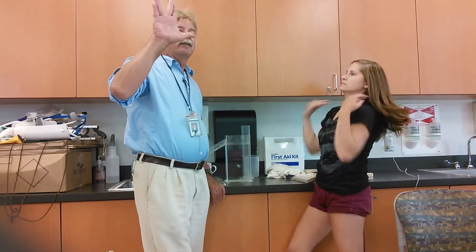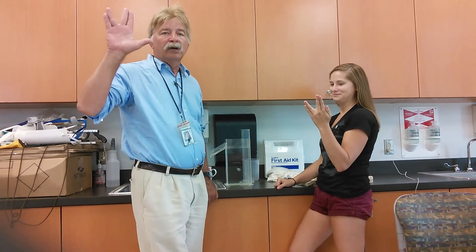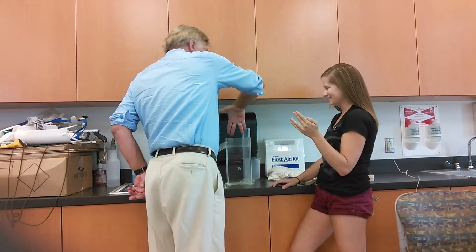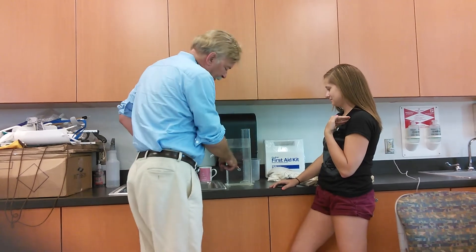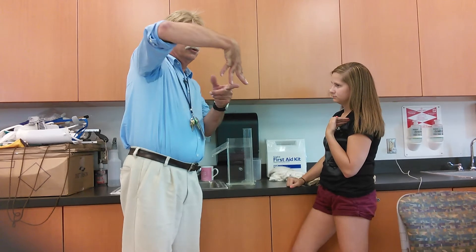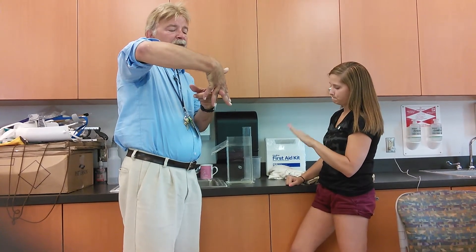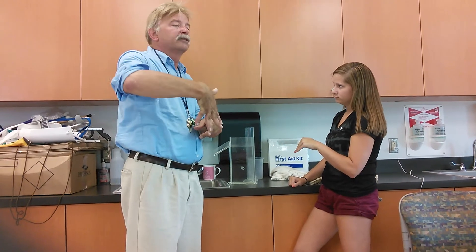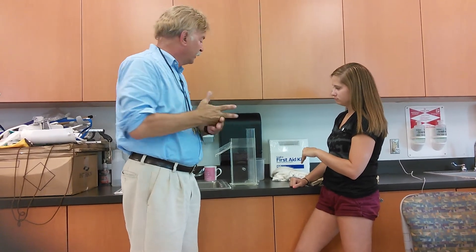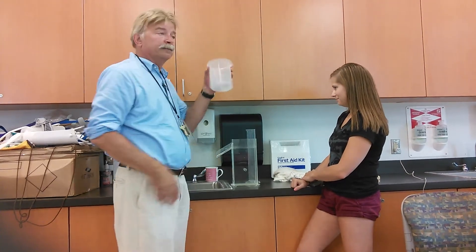What you're going to have the person do, you're going to have them hold their hand like this. They're going to stick their hand in here and there's a bar down here. As soon as the bar hits the web space between the middle and the ring finger, they're going to stop. When they do that, you're going to catch the water in a beaker.